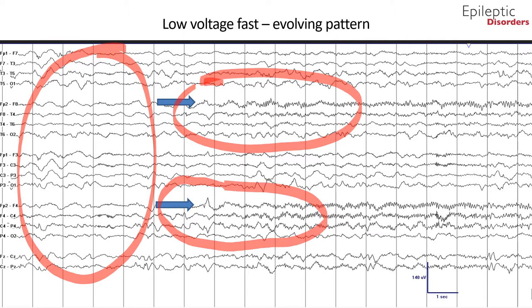This is also known as the onset of the seizure—the first unequivocal ictal electrographic onset—depicted by the blue arrows. Towards the end of the page, you can see how the seizure evolves with low-voltage fast activity becoming more apparent and pronounced in the FP2 and F4 regions.